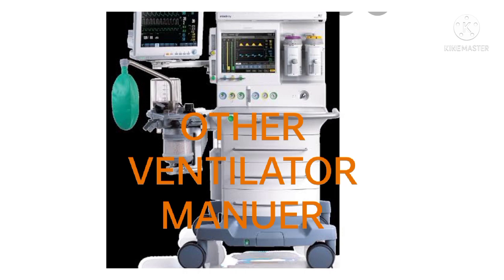PEEP is used with caution in patients with increased intracranial pressure, low cardiac output, and hypovolemia. In these cases, the adverse effects of PEEP may outweigh any benefits.